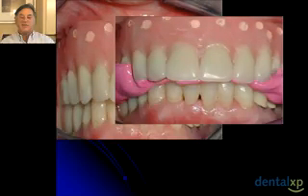The patient will wear a bite when they take the restoration. This is a PVS material. I prefer some of the denser putty materials. And like you see in the upper anteriors, you don't want it to go over the gingival aspect of the teeth, certainly, because you want to see the emergence of the soft and hard tissues in the planning software.